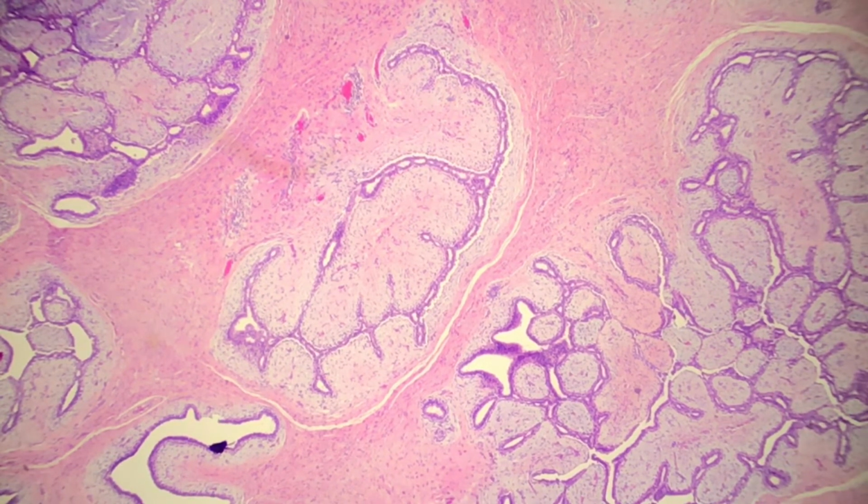Generally, you don't have to stain fibroadenomas. This case was not stained, but if you wanted to, your epithelium generally will stain with estrogen receptor, CK7, EMA, and other keratins, like if you want to do AE1/AE3 or CAM 5.2, those should be positive in your epithelium. In your stroma, you often have scattered staining of ER and PR, CD34, beta-catenin, and remember, if you were seeing mitotic activity and you threw a Ki67 on this, it should be low. And what low means for fibroadenoma is less than 5%.